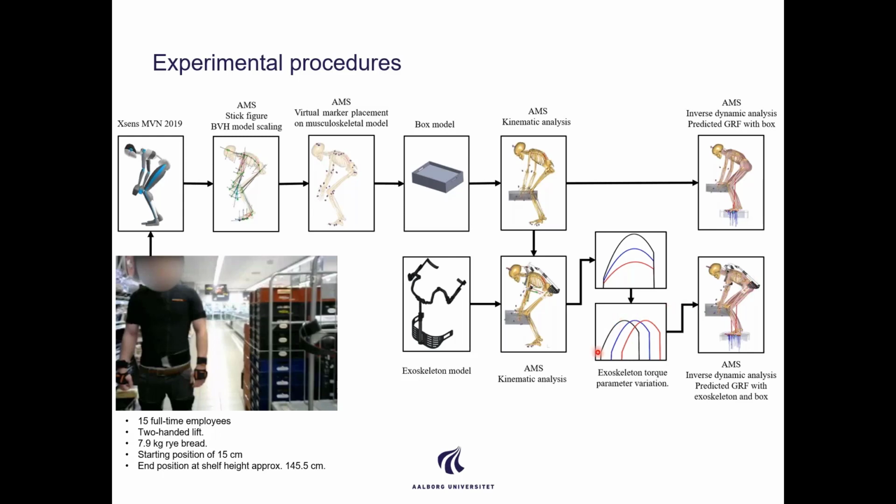If you want to know more about some of the methods that we used, you can check some of these references that I have put down here for the virtual marker tracking and the least square difference method, as well as the ground reaction force and moment prediction method.